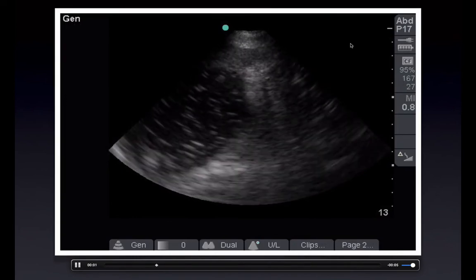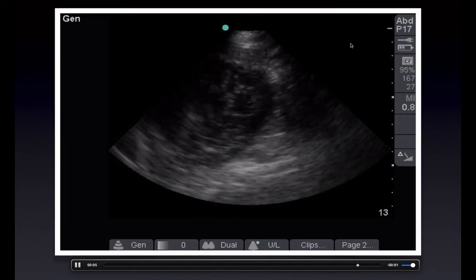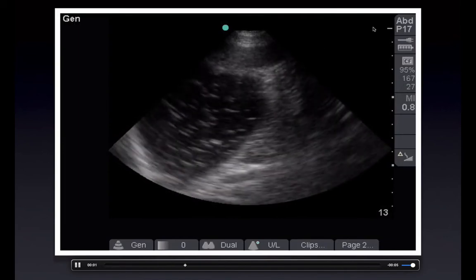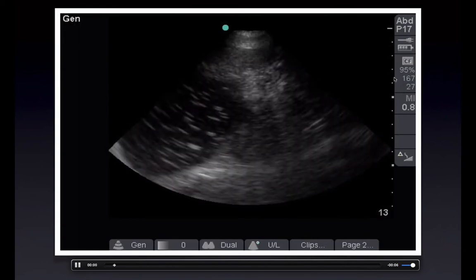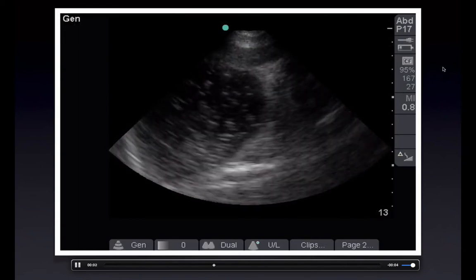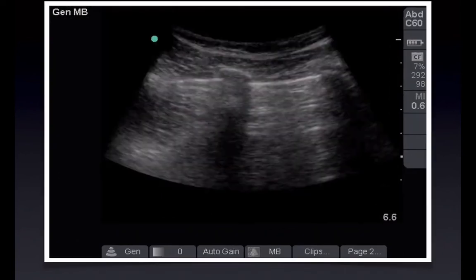Obviously our patients are not NPO before they're crashing into a tree. And sometimes that's probably beer, if I were to say something. And so there's echoes in there. That's a stomach bubble. So if you see it, don't be alarmed. You'll be able to recognize it.